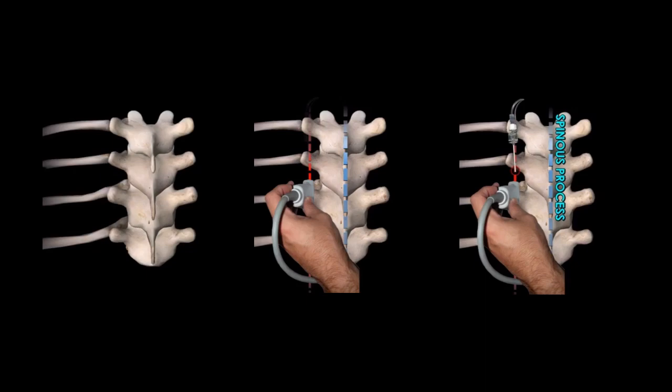With the transducer placed in a paramedian sagittal orientation at the level of T5, the trapezius, rhomboid, and erector spinae muscles appear as longitudinal hypoechoic structures superficial to the transverse processes, which are visualized as squared hyperechoic rims with an acoustic shadow behind. At higher thoracic levels, for instance above T5, trapezius, rhomboid major and erector spinae muscles can be identified as 3 layers superficial to the transverse processes.